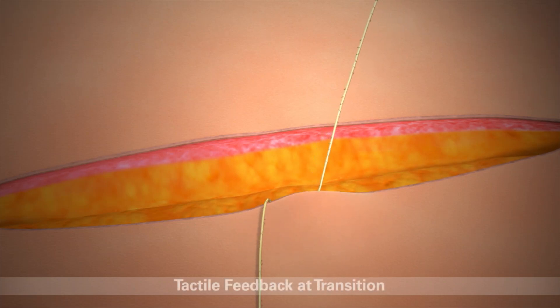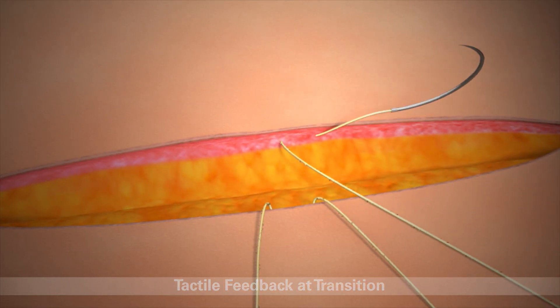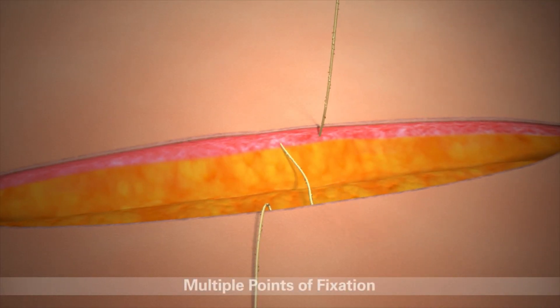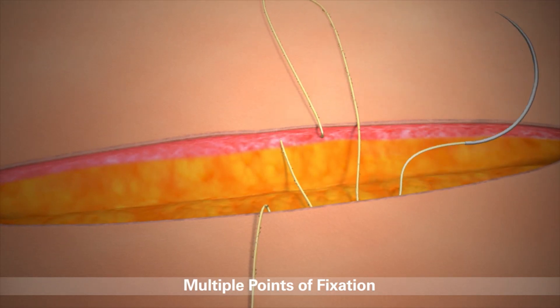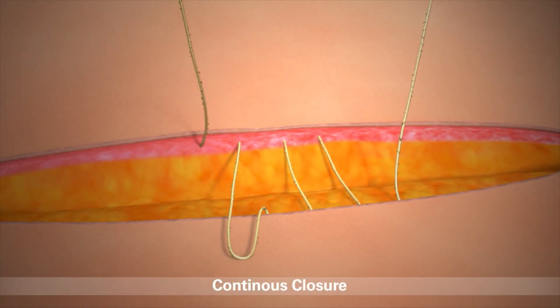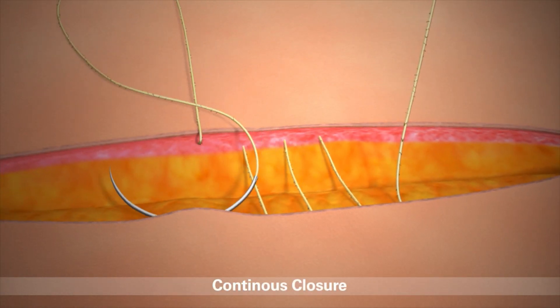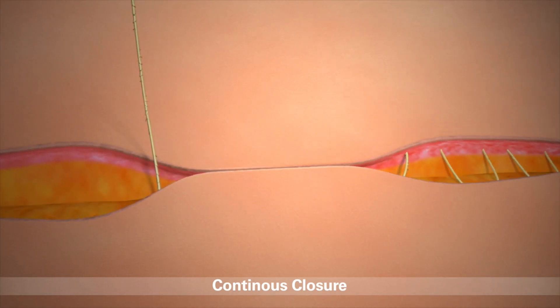Tactile feedback indicates when the transition point in the middle of the suture has been reached. The unique anchor design provides multiple points of fixation along the suture line. It also enables surgeons to use a continuous closure technique, beginning at the middle of the incision. This allows tension on the suture to be maintained on each pass without knots, eliminating knot-related complications.